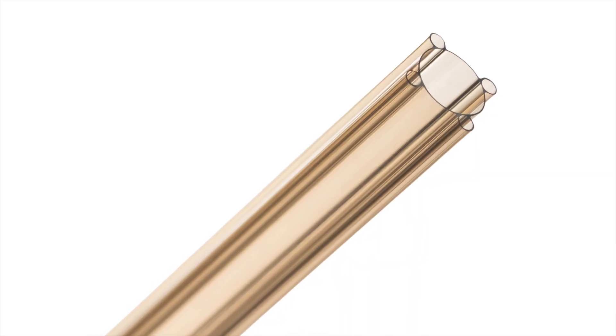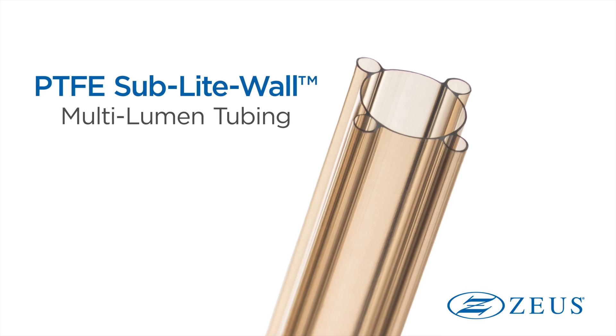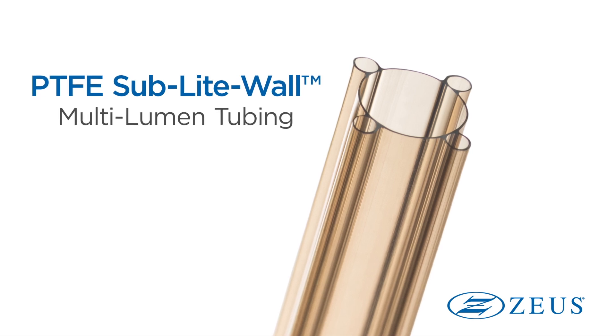Our PTFE sublite wall multi-lumen tubing is a single process-ready extrusion that reduces manufacturing steps and helps improve yields for steerable catheter construction.